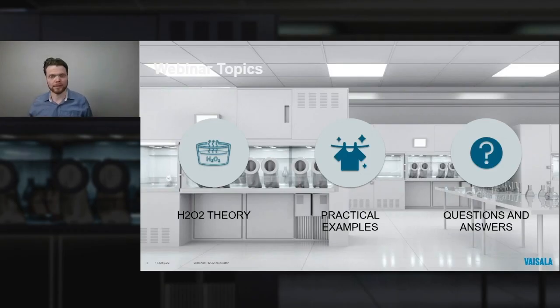First, we will cover some vaporized hydrogen peroxide theory, and then we do some practical example calculations with the simulator. And finally, if you have some questions, I can try to provide answers to them.